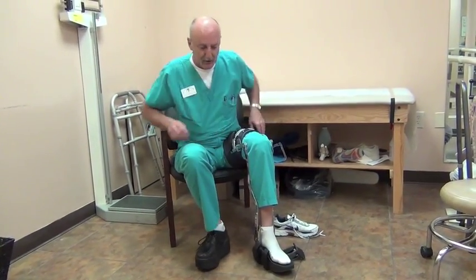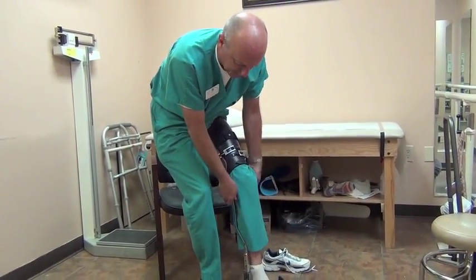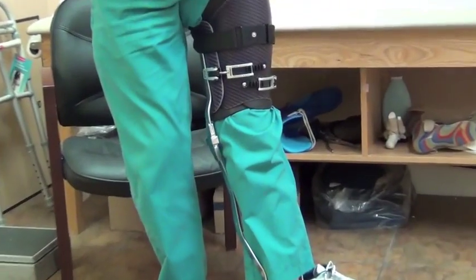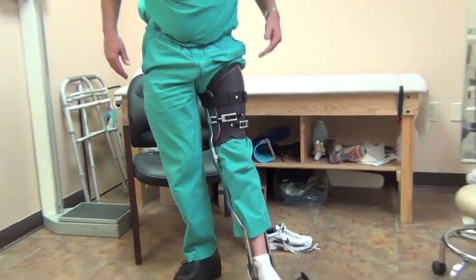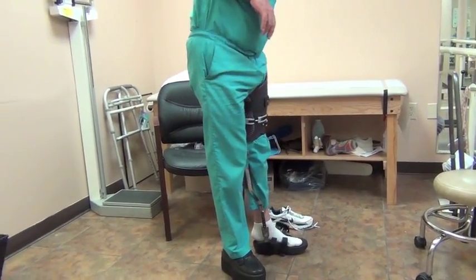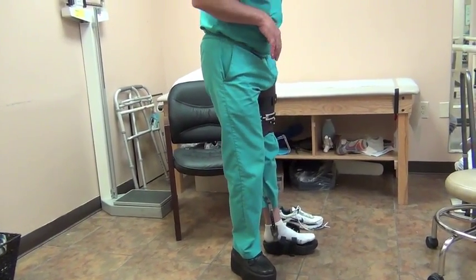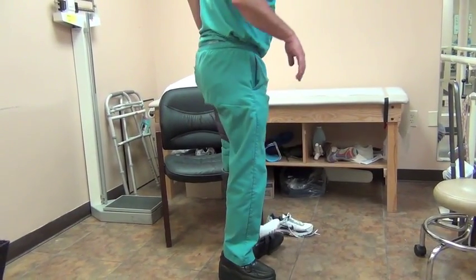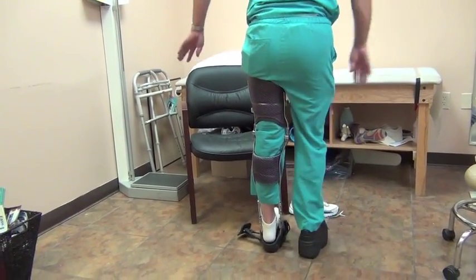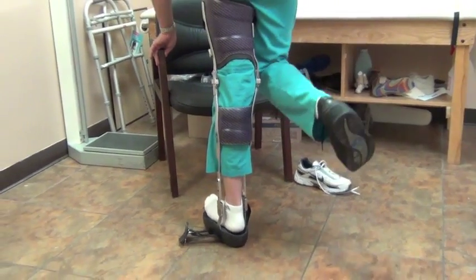What a patient would do would be stand up and extend the knee joint — because my foot's not in a shoe, it's a little tricky. Extend the knee joint and lock the knee joint. They can also do that before they stand. Once they're standing, they'll need one of the long shoe horns so that they can reach back and guide their heel into the shoe and then just slide the heel down. As you can see here, when I'm standing on this, I am unweighted — you can see that my heel is not touching at all.